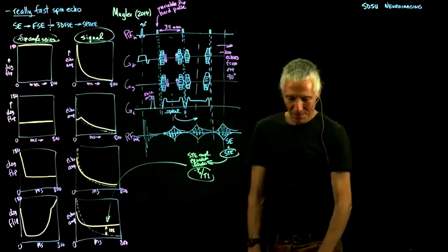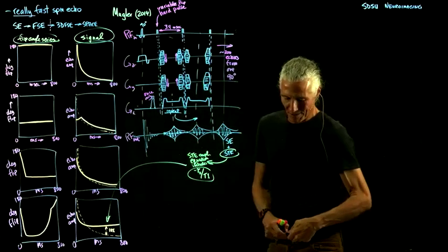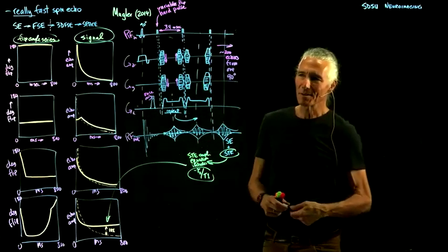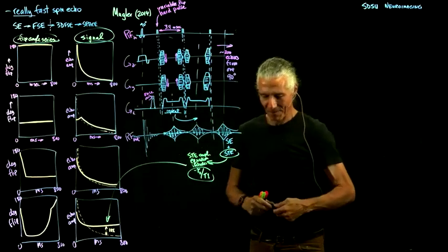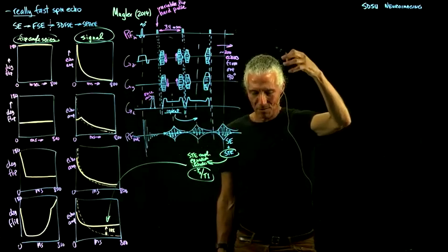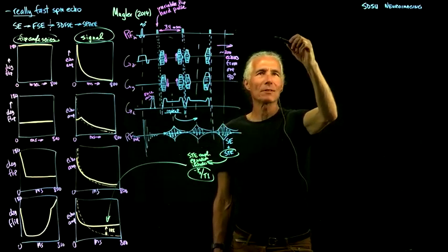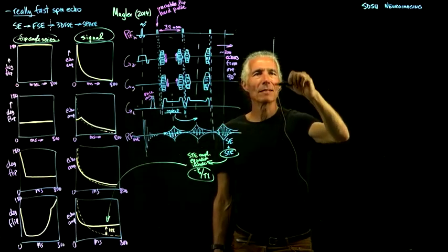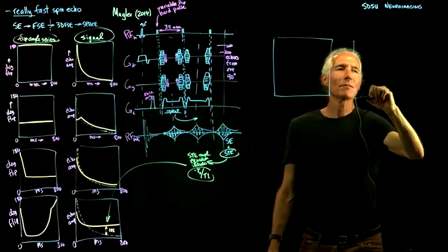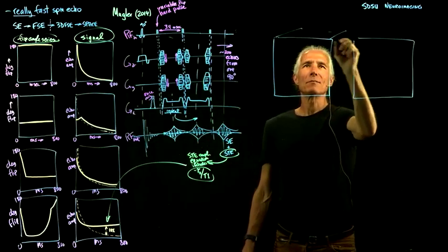And so what's the final insult on how to actually really speed it up? Well, you sort of leave out some of the data. And so what does that look like? So we'll draw two different pictures of how they're sort of leaving out some of the data. And so what I'm drawing here are the 3D K-spaces.